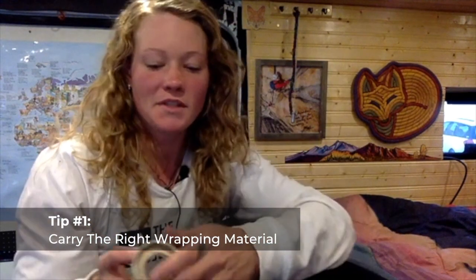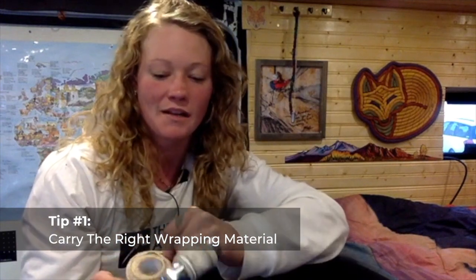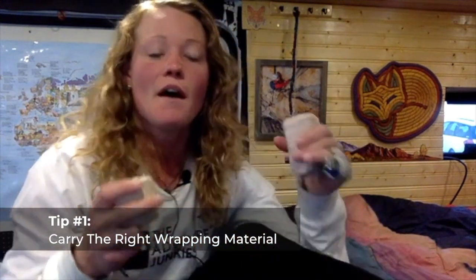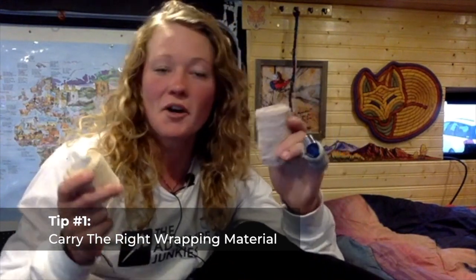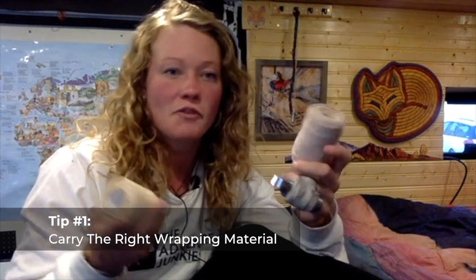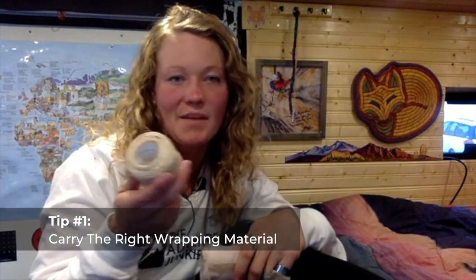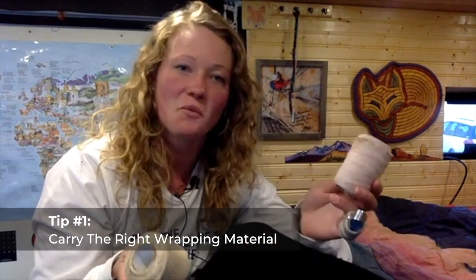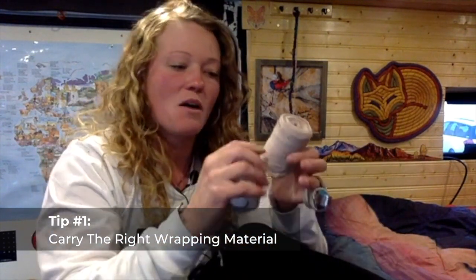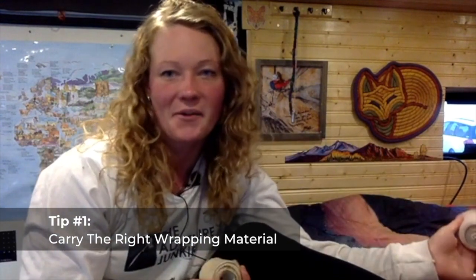Tip number one: the material that you carry with you that is appropriate for wrapping a sprained ankle really does make a difference. I highly recommend some sort of orthopedic specific compression wrap, whether that be an ace bandage or the self-sticking type of elastic tape — either works great. It's ideal to have about one to two inches as far as size goes for ankles.